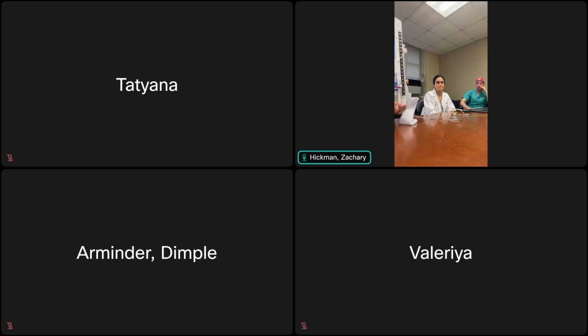So first, I just want to say, if somebody calls you about an issue with the EVD and it's not draining or whatever, the first thing is just to double check the system and make sure everything's set up the way it's supposed to be set up. Like you said, make sure everything's open. Sometimes they'll be clamped in one spot, either here or over here.